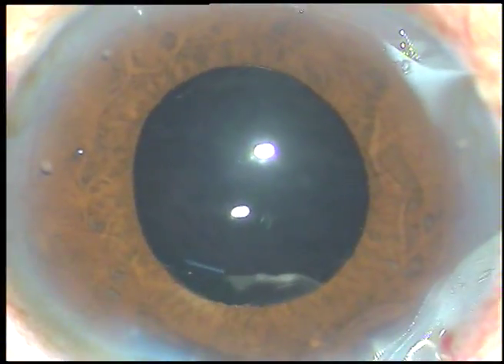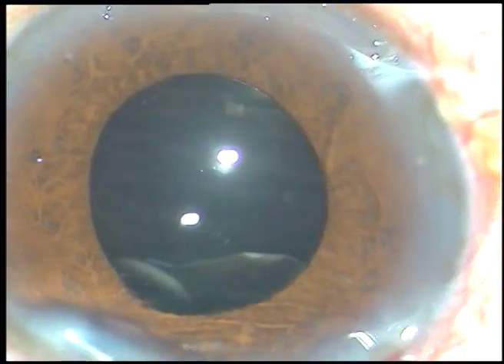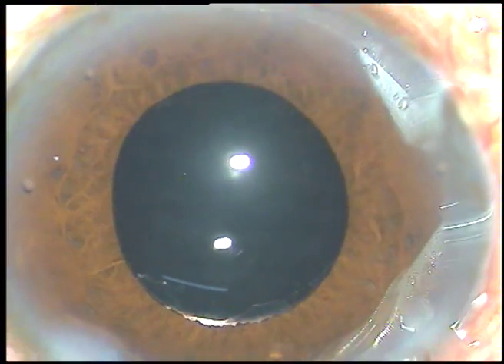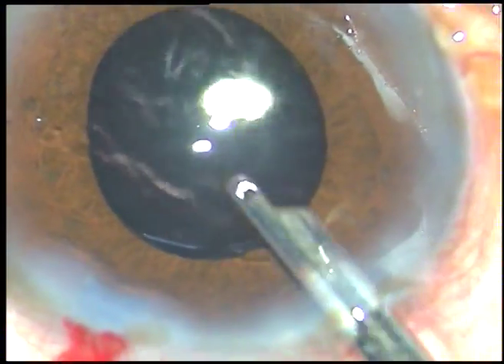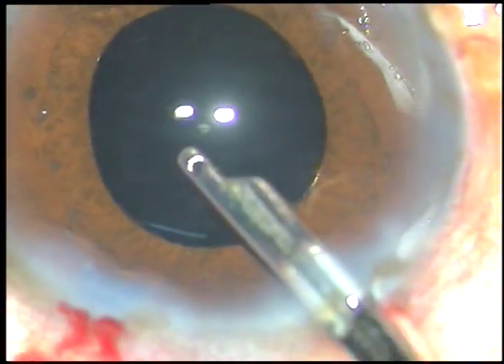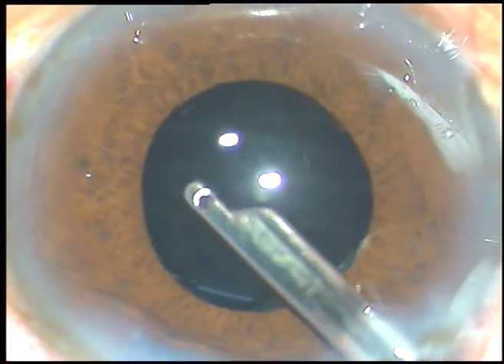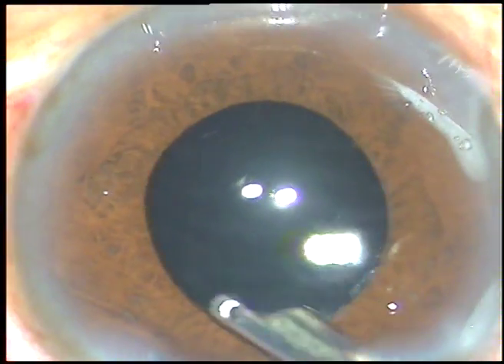This is a bit of moxifloxacin. Now, the side port is nicely hydrated. Stroma on either side of this stab wound is hydrated. This is the final lavage with BSS — a lot of viscoelastic came out, which was sticking to the corneal endothelium. The entire chamber is formed and the case is concluded.